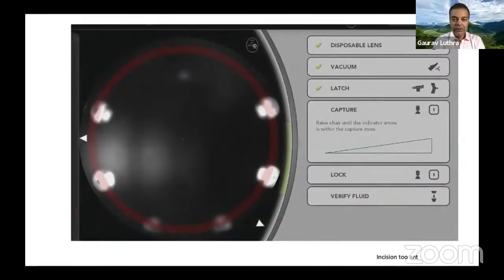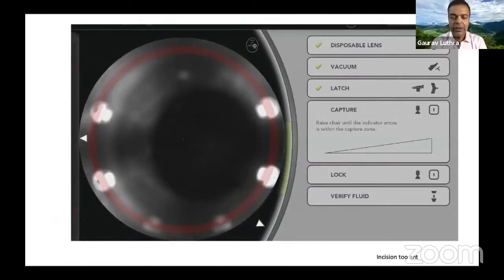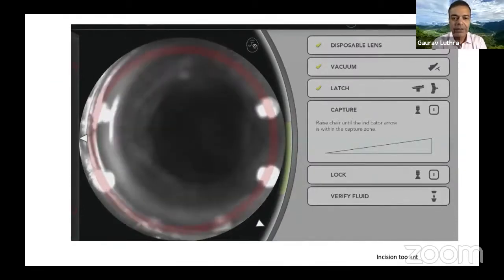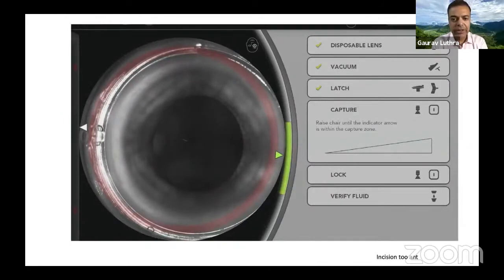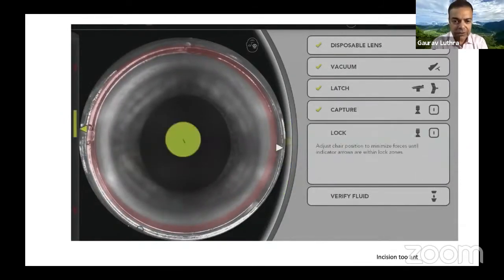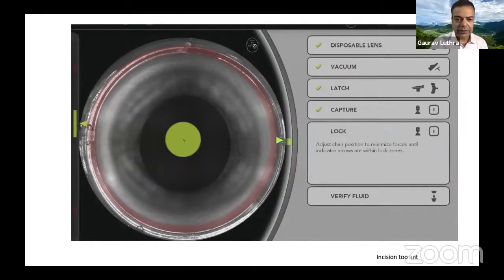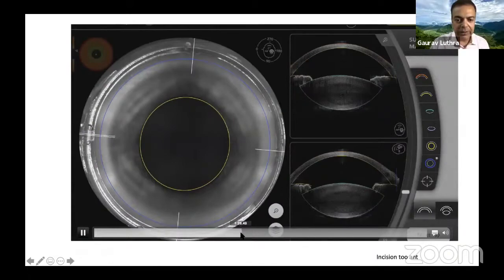because for many reasons, it saves a lot of time, because of the planning and the placement of the incisions on the femtosecond laser, then also trying to open those incisions. Many times they'll open effortlessly. And then there will be other times when you're doing a VIP patient, you're doing a trifocal lens, trifocal toric, and then you suddenly have an incision which didn't open correctly. And just watch this video as it proceeds. Let me take you to the point where the incision is being planned.